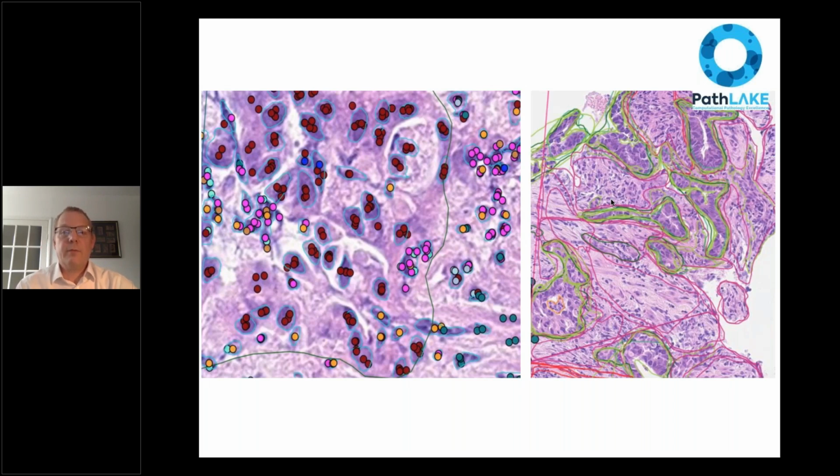And this is the nature of the beast with digital pathology images, even with today's technology, which is pretty good. When you get up to higher resolution images, it is difficult to know precisely what individual cells are in some cases. And we've had rounds of consensus views to agree different marked items of interest where that seemed to be particularly important to the algorithm, that we try and get a consensus view to what a particular object is. But it's important that you get some degree of measurement of agreement.